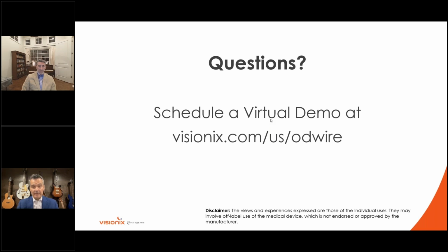So Adam, I'll take that one first. From measuring the cornea, it is the only technology we're now using because of the advent of the topography and the anterior and posterior surface measurements. It's the only measurement that we're now using to monitor the cornea over time.